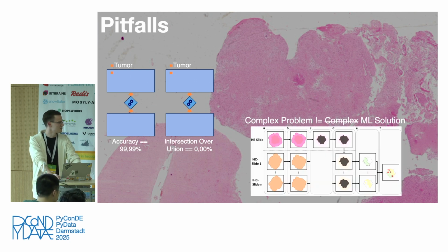For example, we have this strange graph here we can basically ignore. We put in some images, we get the tumor in the image, we apply it, and then we simply do thresholding in the end. This is actually used in research projects currently to determine which killer cells to insert into your body to fight cancer.